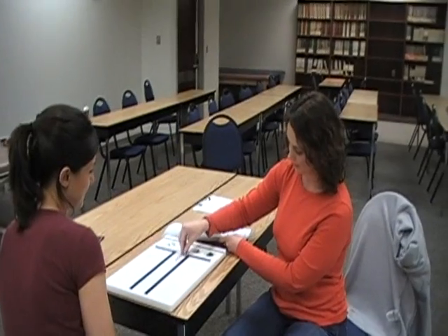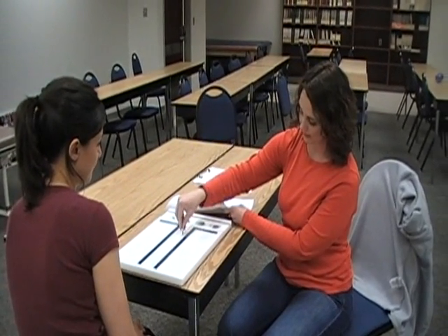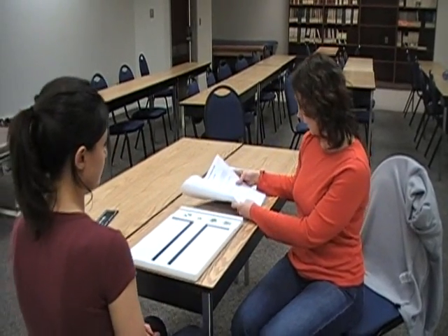Say 'Stop.' Then count the number of pins inserted — one, two, three, four, five, six, seven — and record that as the right hand score.